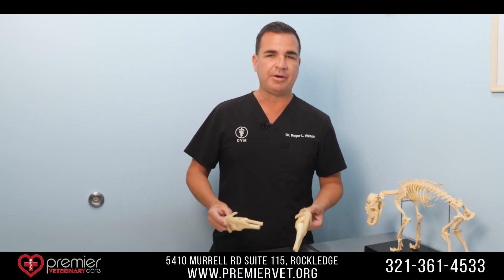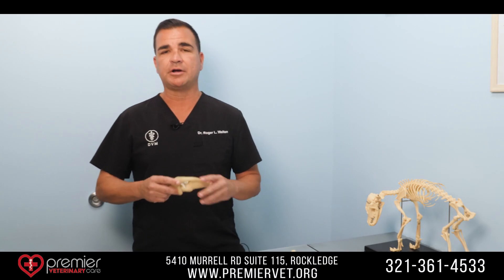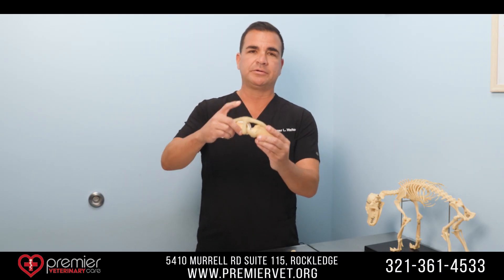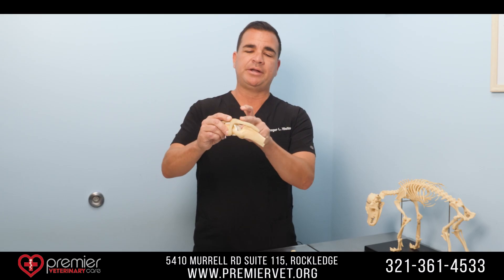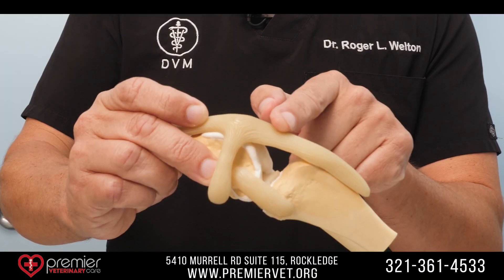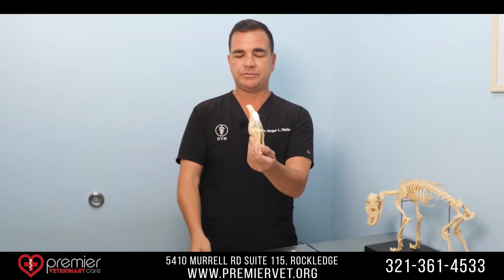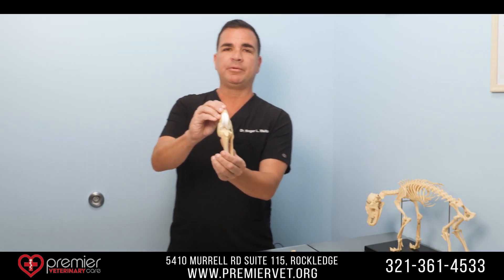The procedure specifically we're talking about is called the tightrope, but first let's talk about the cranial cruciate ligament. This is the canine knee — what you see here is the patella, this is the patellar tendon that runs over and forms the front part of the joint and we insert here at the tibia. I'm going to pull that away for you — this model is quite anatomically correct and represents the cranial cruciate ligament.